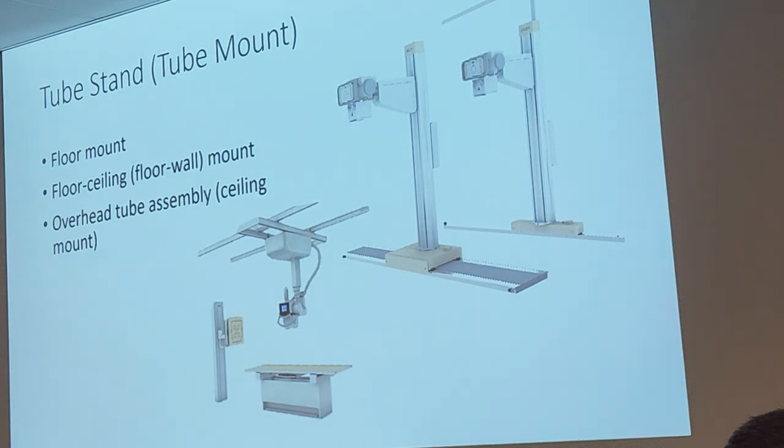ICU. You've got to have specific areas with equipment. All right, so ICU is specific areas with equipment. So normally ICUs will not have built-in X-ray equipment. Well, I meant not ICUs, like mostly interventional areas or a specific X-ray room in a department. Okay, a specific X-ray room in the department. So maybe you've got these ceiling mounts in some other rooms, but for this one specific room, you would use this instead. Okay. Probably cheaper.